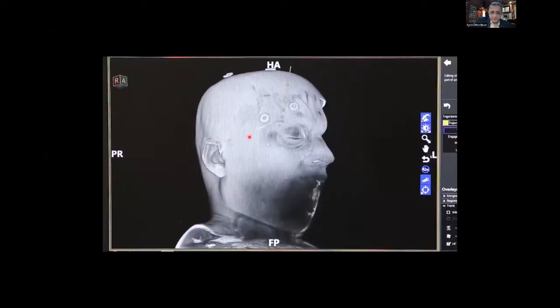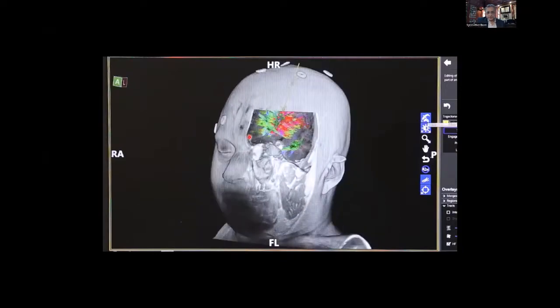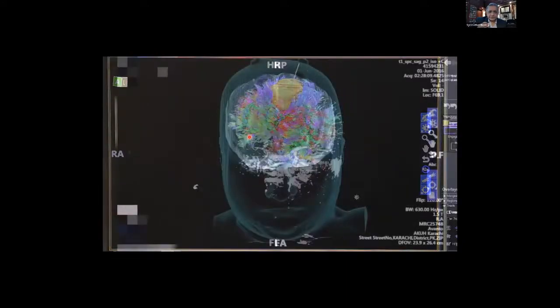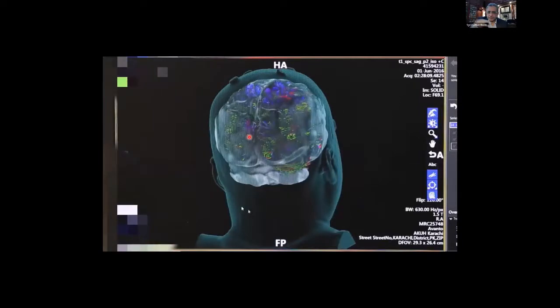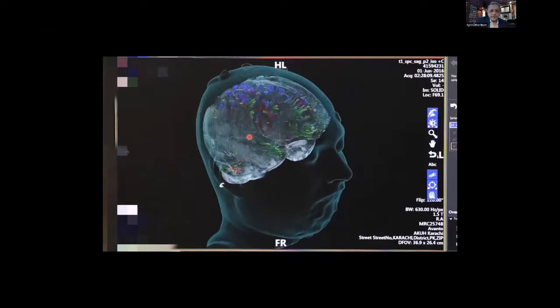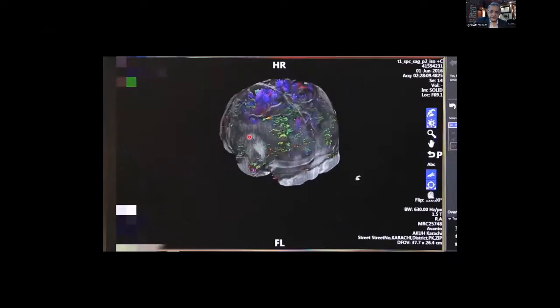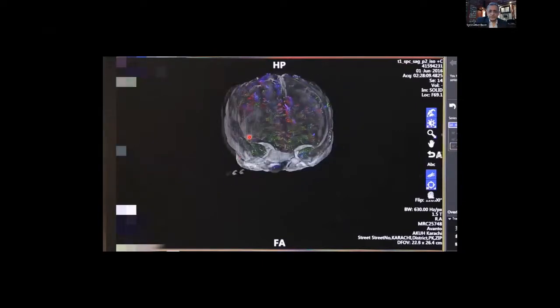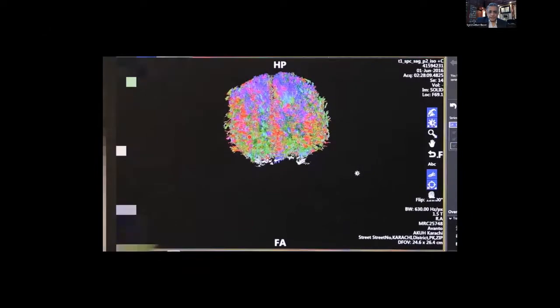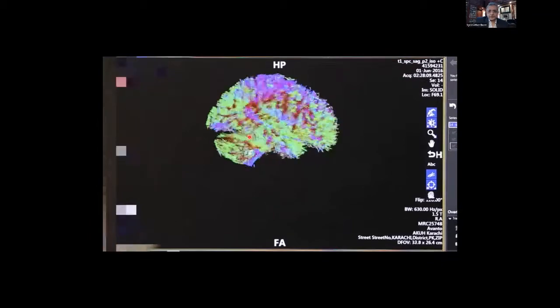I don't think I have time to go over this, but because of this, image analysis can actually pick up the fiber tracts. Typically, when the fiber tracts are passing laterally, left to right and right to left, they are colored red. That is arbitrary, because with the signals obtained, you can further process it and color that red. Those that are passing craniocaudally are colored blue, and those that are passing occipital-frontal in that axis are colored green.